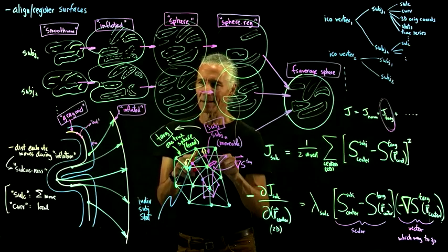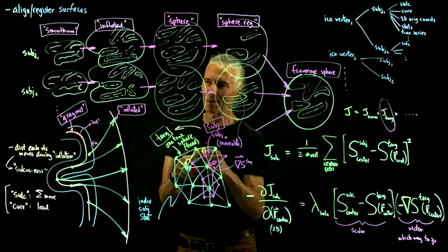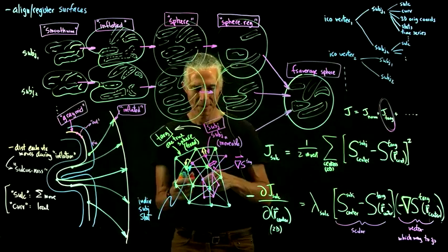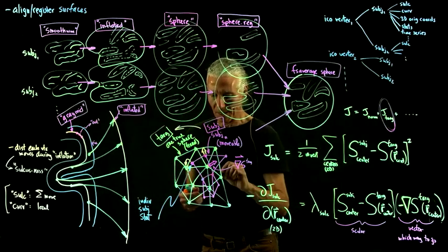We've got to take a gradient of the target in order to figure out which direction we should go. So if we wanted to go to a higher amount of sulcusness, we just need to know what direction is the higher amount of sulcusness, and that's what the gradient measures. And then all at the same time, trying not to distort the surface too much.